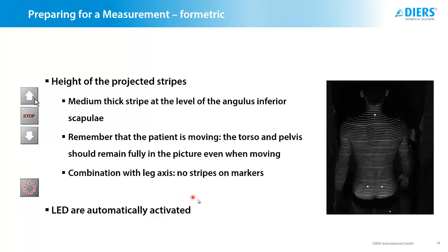The LEDs are automatically activated. It's slightly different from the postural lab where you have to do this manually. But as we expect the use of markers in the motion lab, the LEDs will be switched on automatically for you.